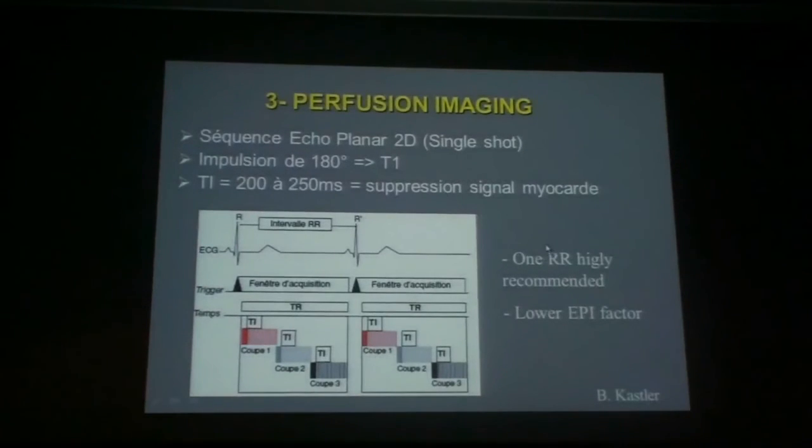Okay, so if we look at perfusion imaging, first pass. The first pass is based again on the RR interval that needs to be stable. I want to insist on the fact that if I'm talking about these sequences, it is because when you do cardiac MRI, it is very critical to understand how it works to optimize your images. It's less technical in terms of anatomy compared to bone imaging, but it is critical in terms of quality of the image you're going to acquire to get the right analysis.